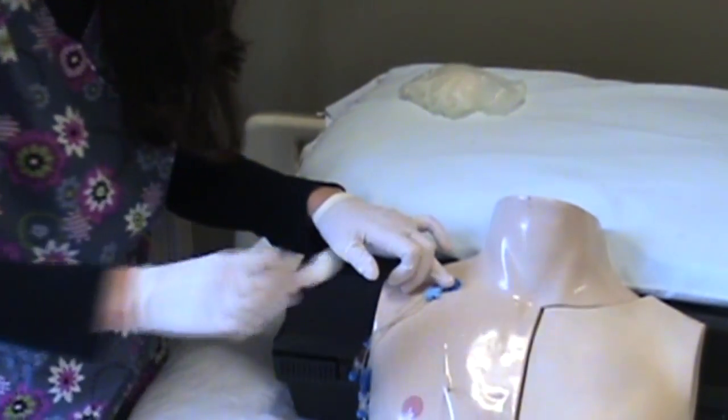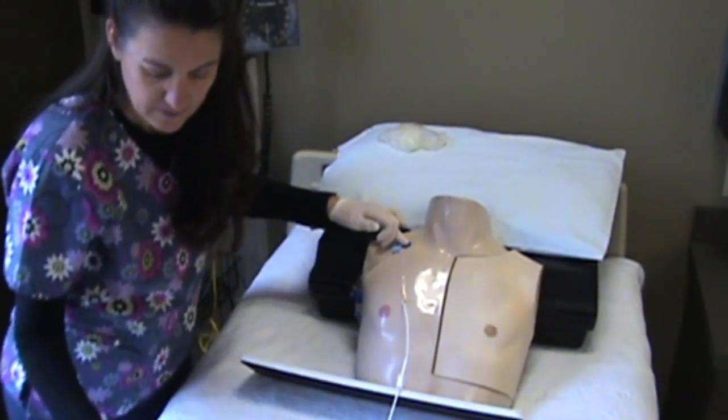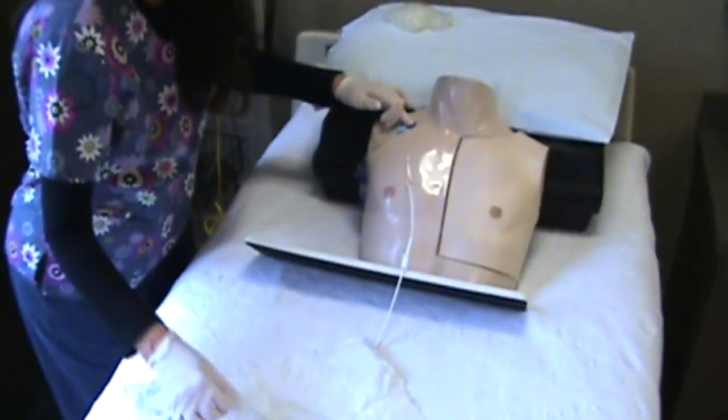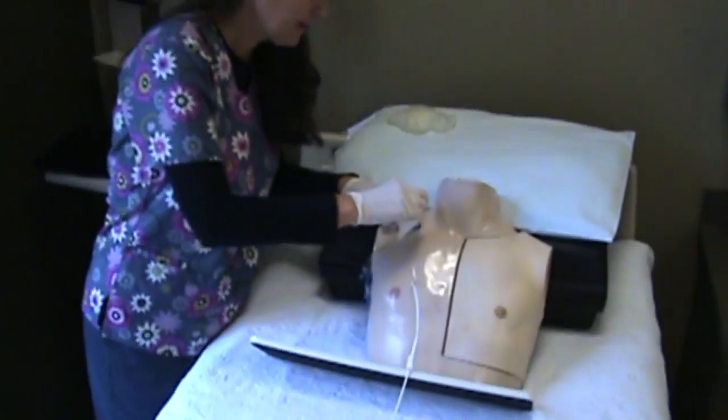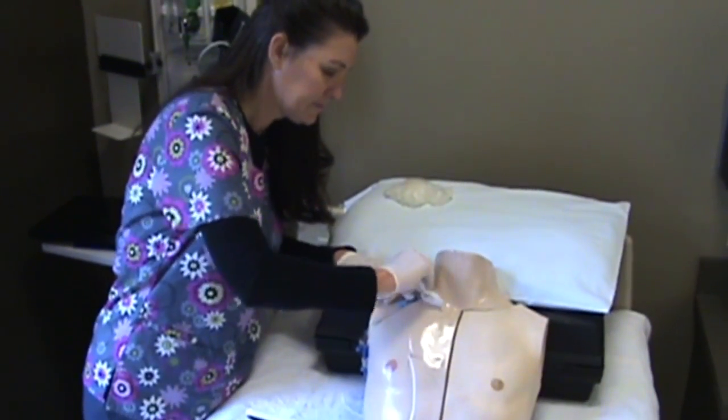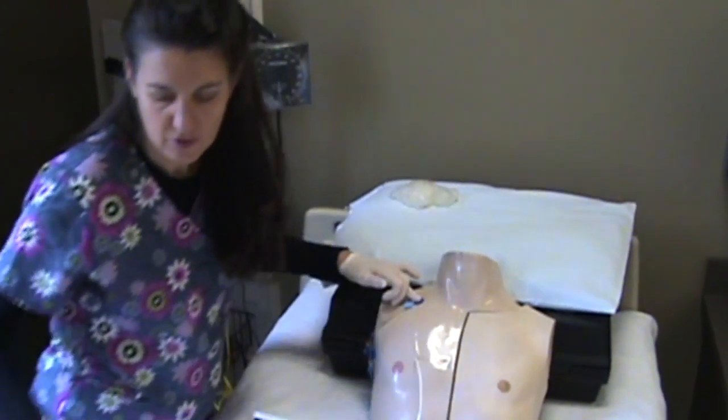At this point, if you need to, you can take your dressing and dry it off and go around your sterile field.